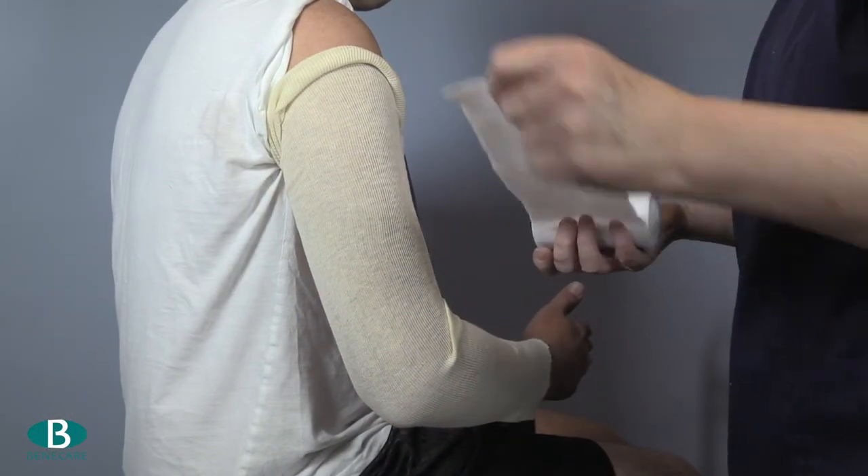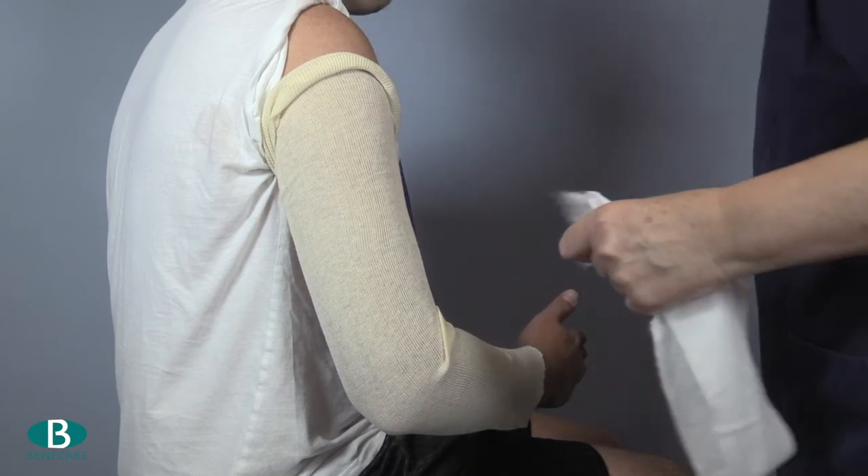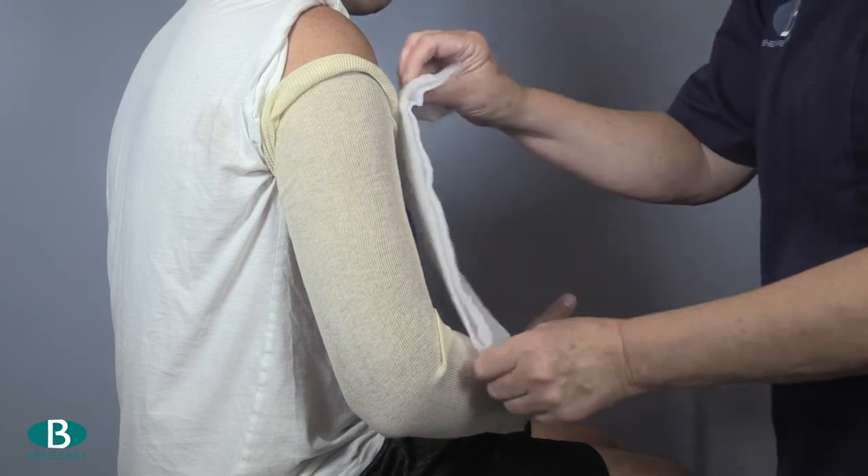Apply padding along the anterior border. I have used a double layer of undercast padding. Adhesive felt padding is a good alternative.